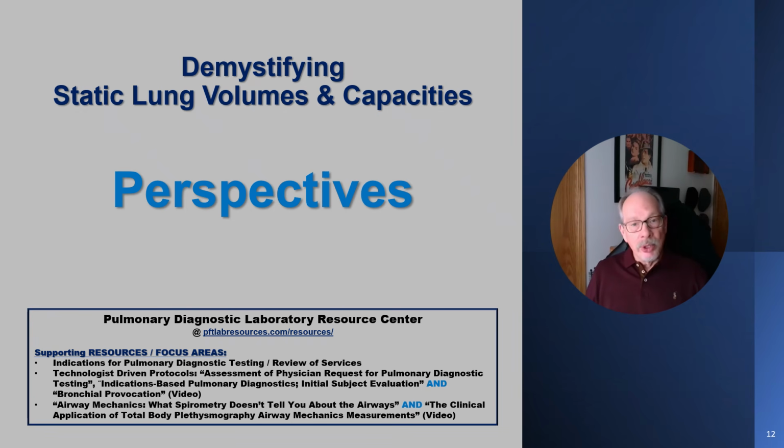Due to methodological differences, however, VTG values may be nearly 9 to 10% higher than multiple breath gas dilution FRC measurements in normal individuals and individuals with restrictive lung disease. This difference is accounted for because not all airways are patent at any given period of time, since there continuously exist small yet diffuse amounts of unventilated lung.